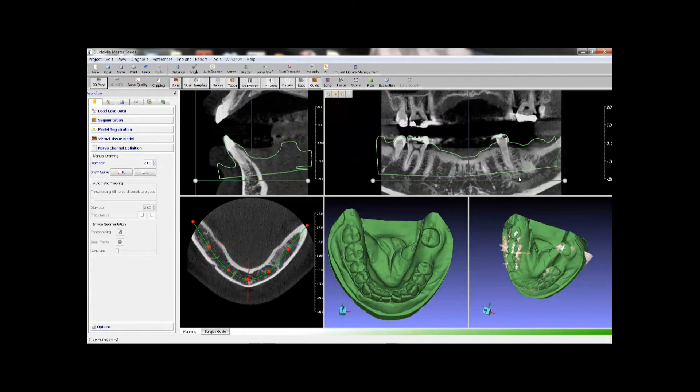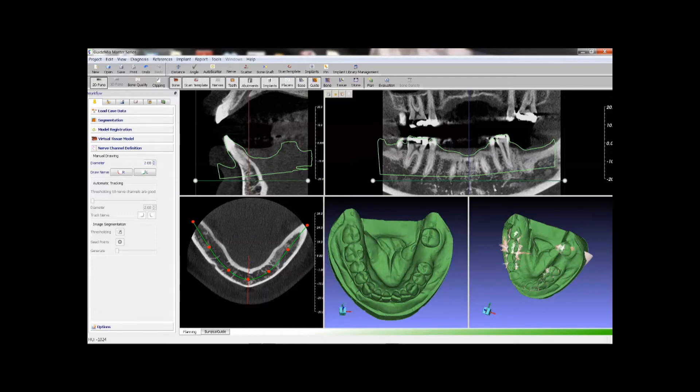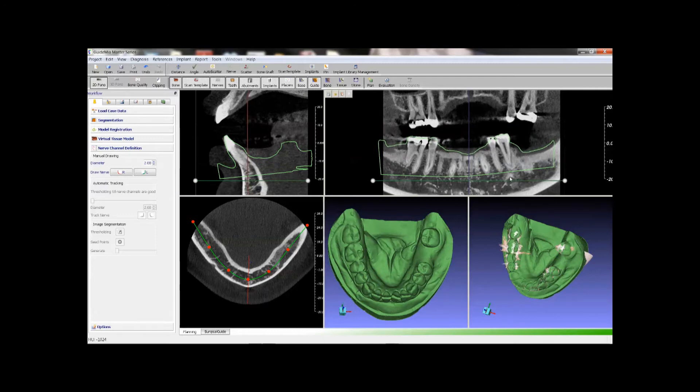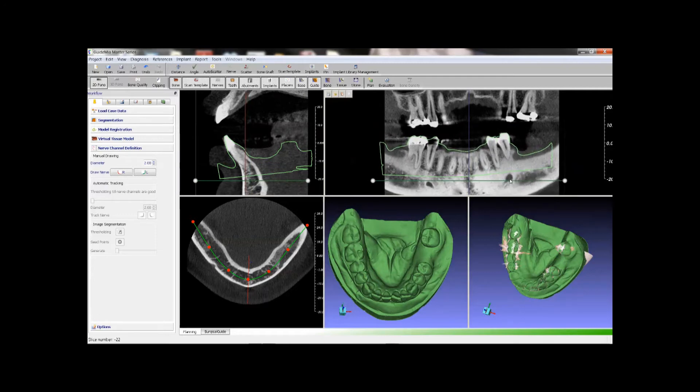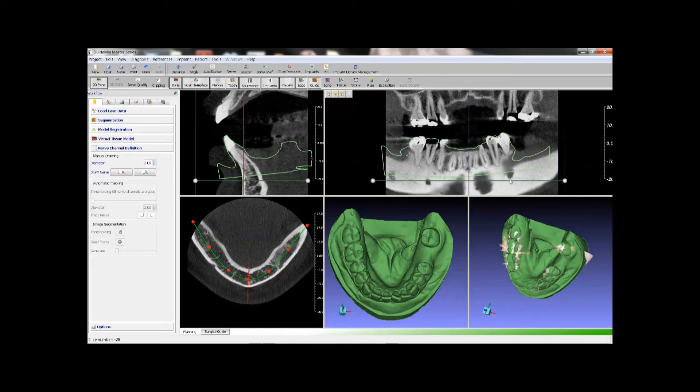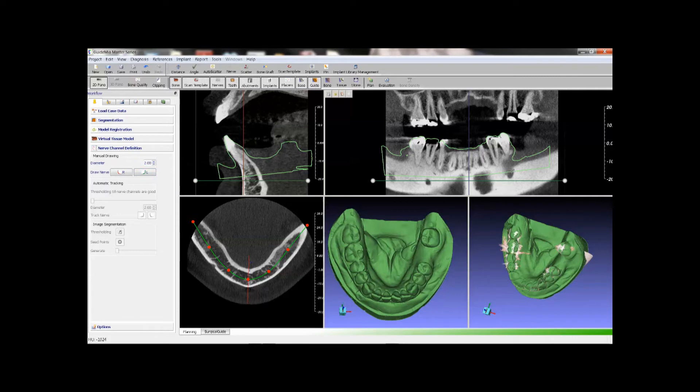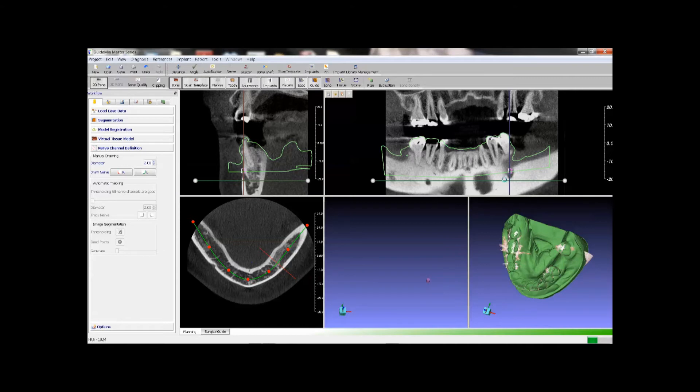Then we go to the nerve channel tool box. The 2D views are in panoramic mode now. Use mouse wheel to change slices to identify the nerve channel. We will create the left channel. Click the button first. Place point on the slice, and scroll to other slices, place more points. Notice other image windows are being updated in the same time.